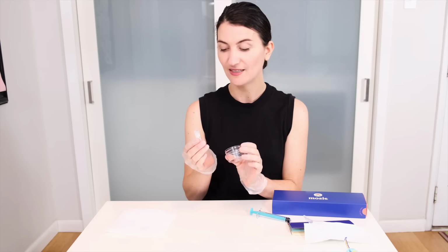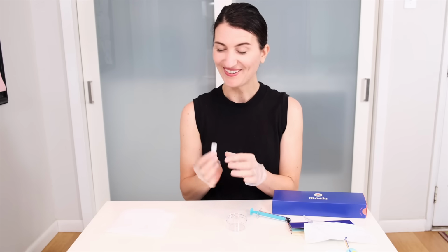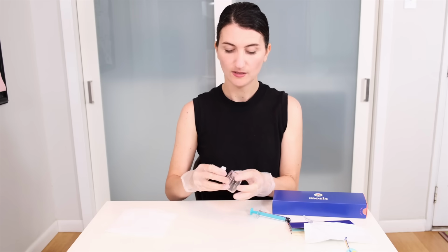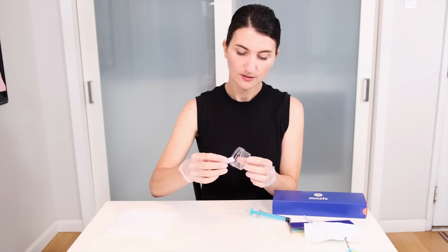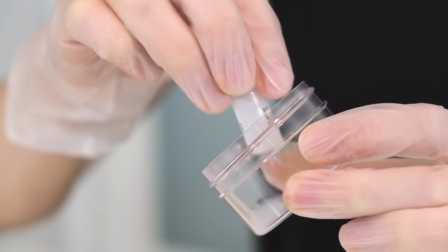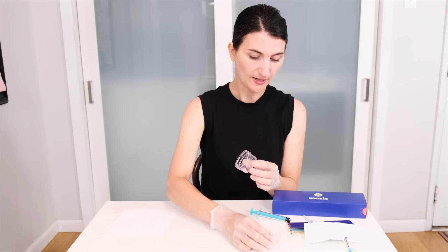So as we prepare for the big transfer, key thing to think about, when you pour it in, you want to make sure that you stay in one spot. You don't want to be dribbling around, dropping it here and there. Just naturally pour it in. So here we go. You'll screw it off. It's a screw top. And you will gently transfer it in. Okay, set that aside.